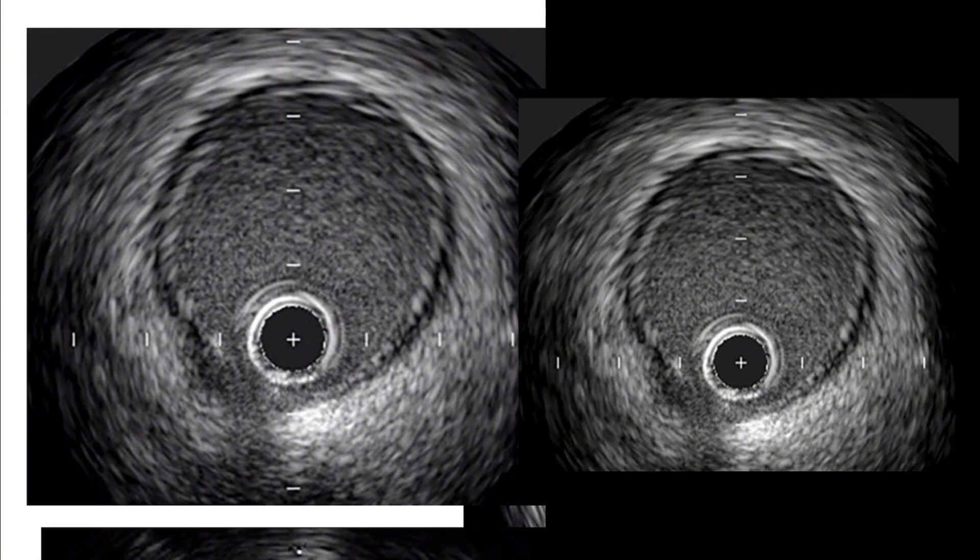So the catheter is like a perfect concentric circle. If you see this pretty perfect circle, you have some halos out here — but you definitely have a perfect concentric circle. That is the IVUS catheter, or OCT catheter if we're talking about OCT.